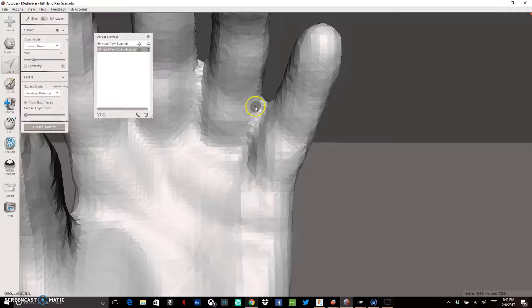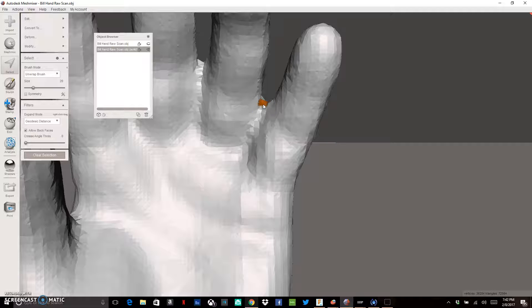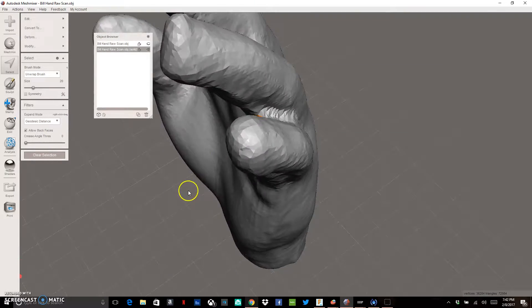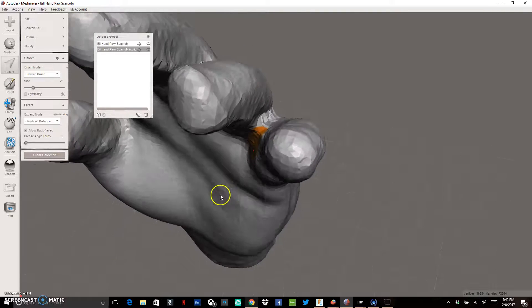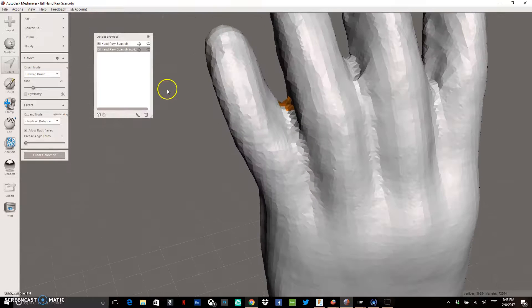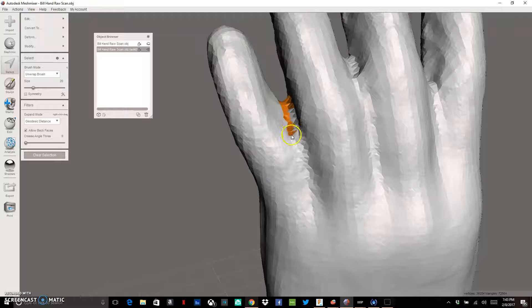Hold down the mouse button and drag to highlight the pieces you want to select. I'm dragging around to select out the space I want to delete — all the area that's causing a webbing look between the fingers. Select a little bit more than you'd normally want because you can fill some back in later. Use the right mouse button to pan around and select the opposite side of the finger webbing.